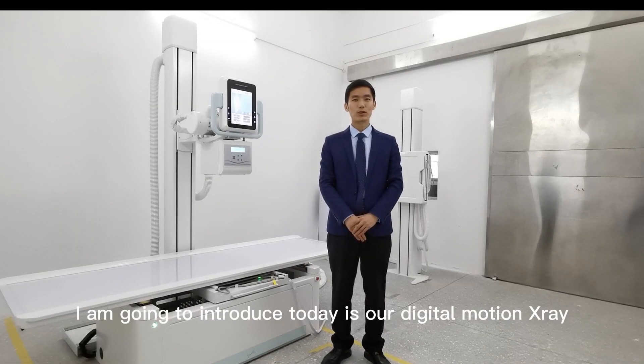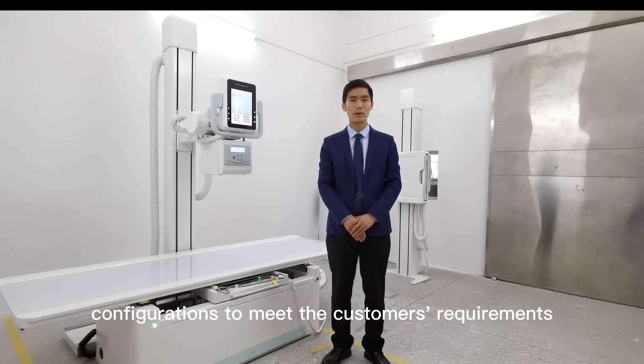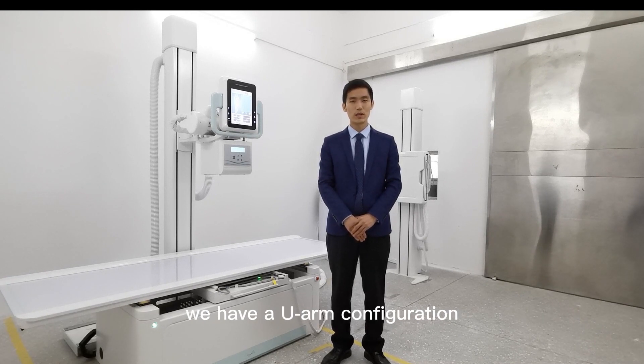The new model I am going to introduce today is our Digital Motion X-ray, the PLD-79-00 series. The PLD-79-00 series has different configurations to meet the customer's requirements.